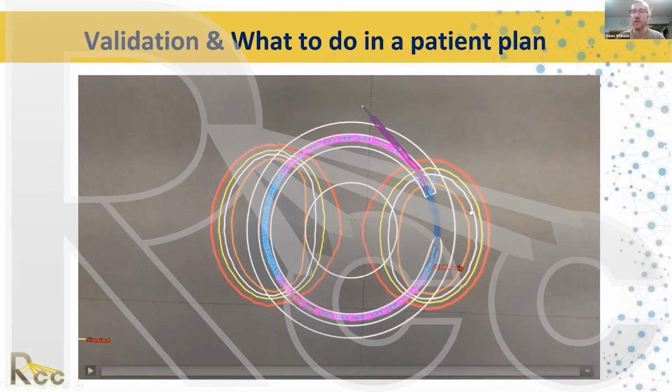Definitely. So if it's a little too weird with the dosimetry plan and the delivery plan, a nice way is just extending this reconstruction point by that offset amount further. In our case, it was 5 millimeters. And then whatever you plan, you deliver. And so your dosimetry looks like what you deliver. As long as you don't use those first, however much you commission. In our case, we can't use the first 5 millimeters of dwell positions, but you might commission it differently.